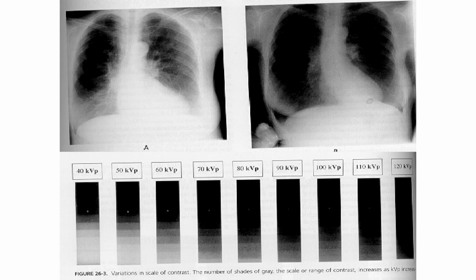Okay. So kung makikita natin dito sa dalawang image, sa letter A and letter B image. Okay. One is taken using a high contrast and one is taken using a low contrast technical factor. So alin ang merong high contrast?